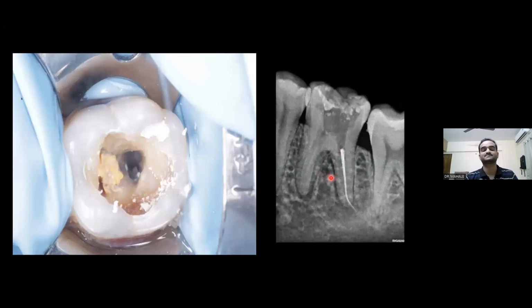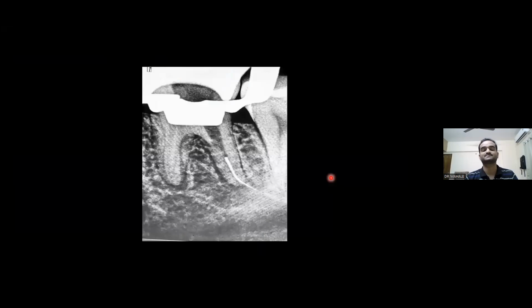And after half an hour, this was the result. This was my reaction. So a secondary fracture of the file is seen in the middle third of the canal. And I was like, where did I go wrong? Okay, I was wrong since the starting of the case.